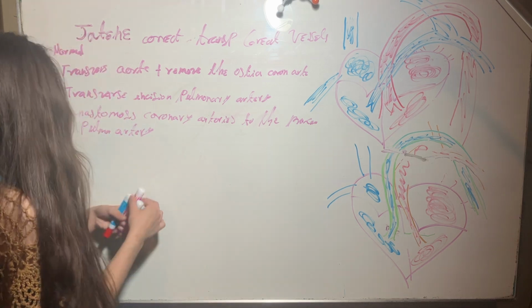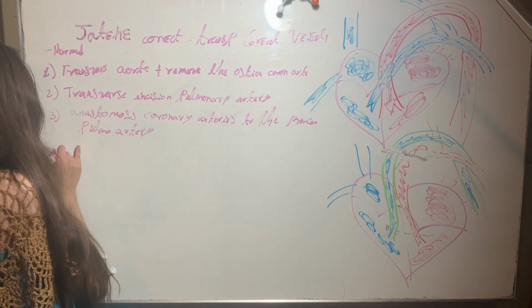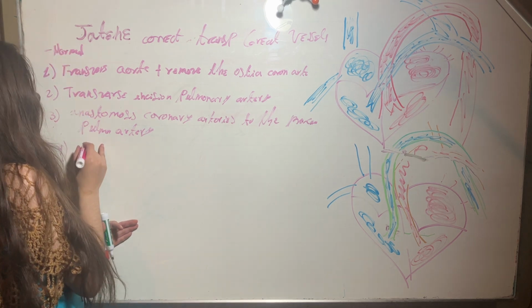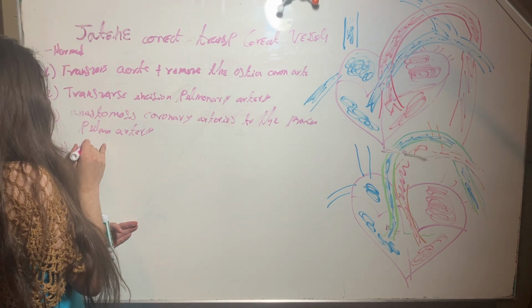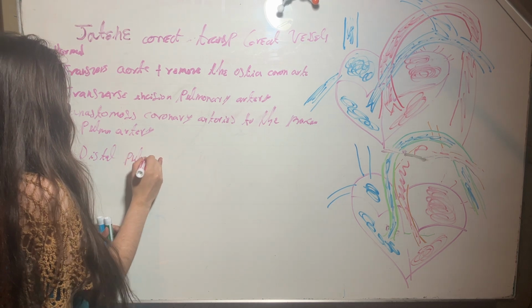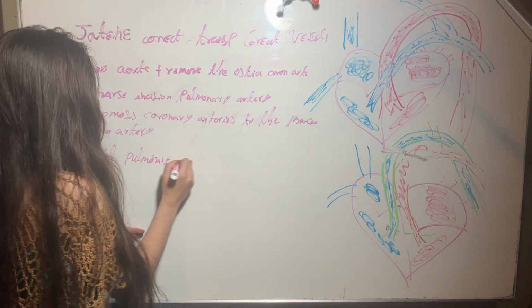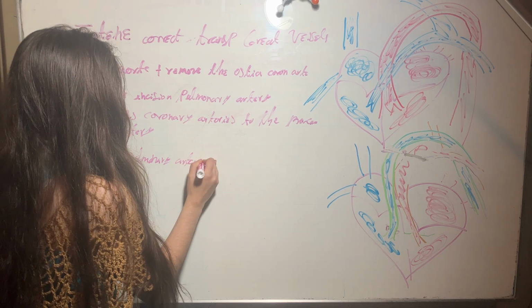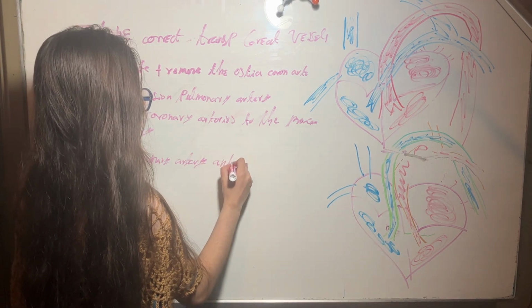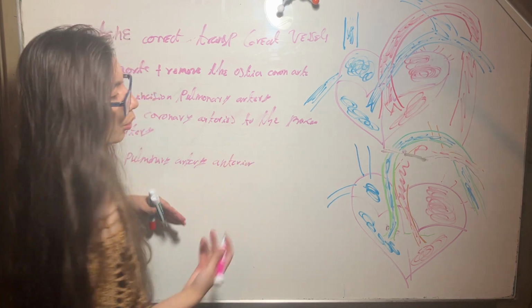Step 4, we are going to bring the distal pulmonary artery, and we are going to bring it to the anterior portion of the heart.